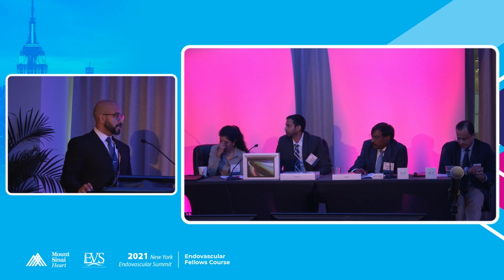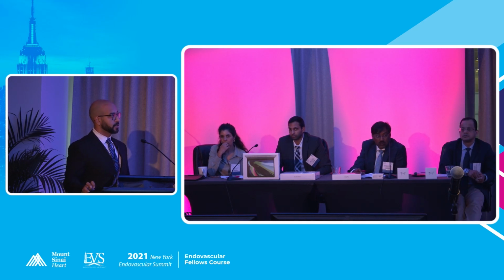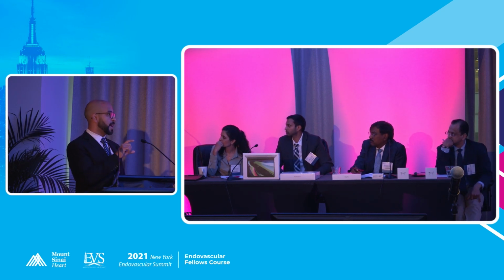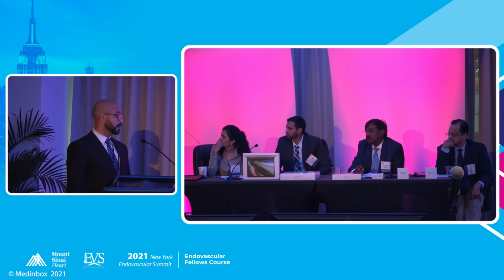So the way that we size our stent graft, we do a couple of things. If I could go back to the slides for just a second, I could show the CT to kind of answer that question. No problem. So we do a 10% size increase in the way that we measure it, one with IVUS, and two, based on the CAT scan, looking at an area that's approximately 3 centimeters of length of the aorta that is uniform, and within that area, measuring wall to wall of the longest length of that crescent portion of the aorta, and then upsizing from there by 10%, and then confirming that with IVUS.